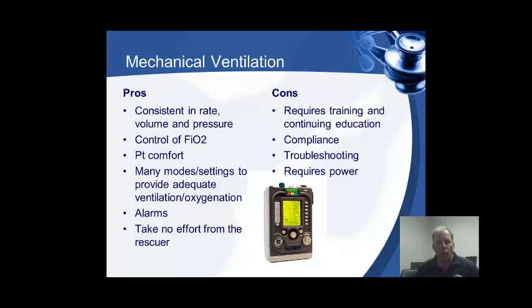Your patient will be more comfortable. You apply certain modes and settings. You can give adequate ventilation and oxygenation and make your patient more stable. It's going to alarm and tell you whenever something's going wrong, give you a chance to fix it. What's great about this vent is it gives you a window whenever you have an alarm, and if you read through the stuff on the screen, it'll tell you all the possible causes of that type of alarm, and at the bottom it'll give you a recommendation of what you should do.